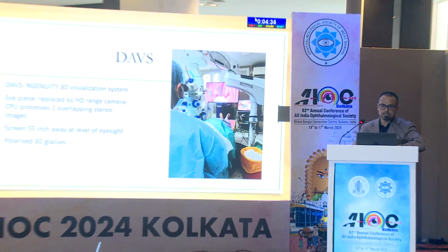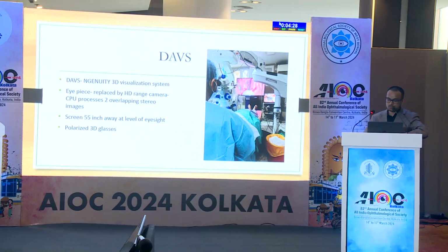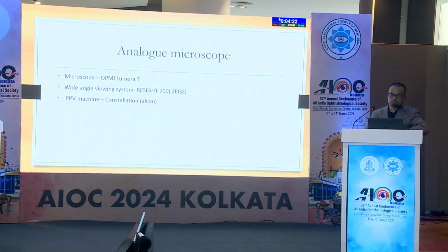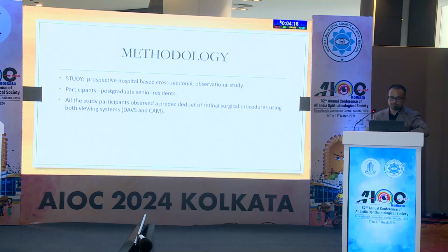Good afternoon, everyone. Today's topic for presentation is digitally assisted vitreoretinal surgery versus conventional analog microscope, our experience at a tertiary care center in Eastern India. Retinal surgery is a very intricate procedure in which we need a high level of dexterity, so we need a good visualization system. In our study, we used the Ingenuity system from Alcon, in which the eyepiece lens is replaced with a high definition camera, which projects the image on a 55-inch screen that can be seen with polarized glasses. In the analog microscope, we use the OPMI Lumera T, and the PPV machine we use is the Constellation from Alcon.